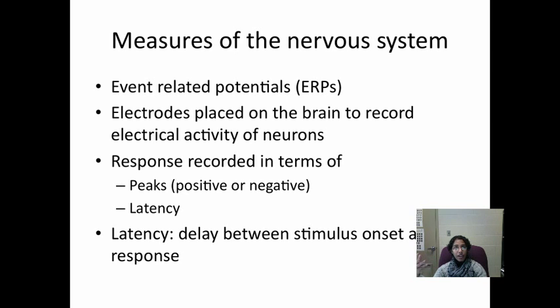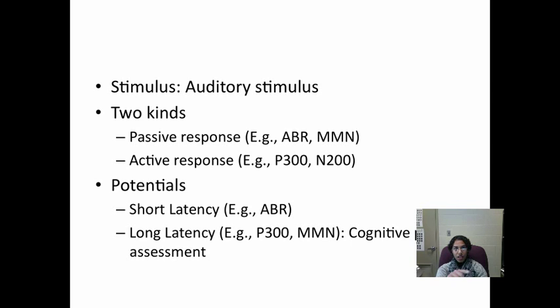If anybody has been at the hospital and you've had a baby, the first thing that they do is to screen your hearing, right? So they'll come in and they'll place a couple of electrodes, one behind the ear, and they'll get something called the ABR, auditory brainstem response, which is a short latency potential. It's a click, click, click, click, and it's the brain's ability to perceive that click, okay?